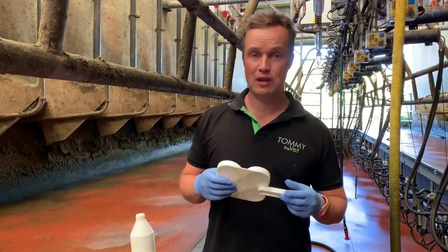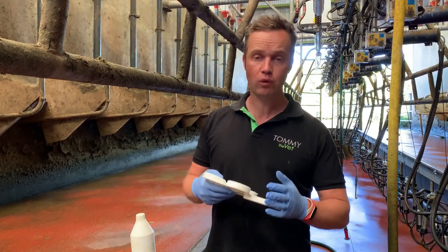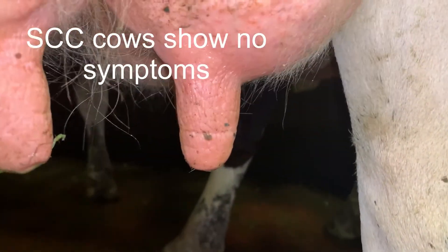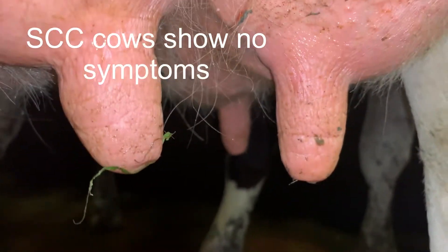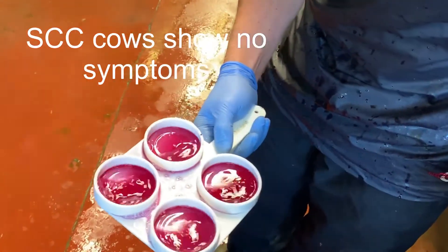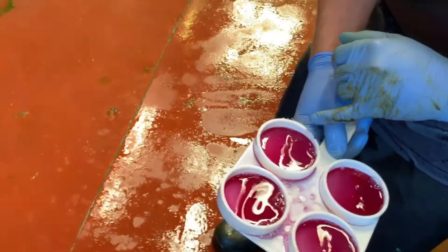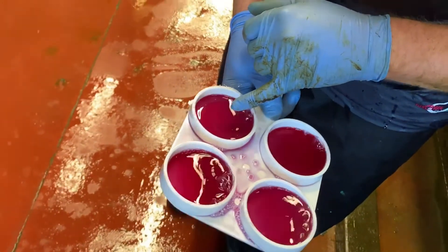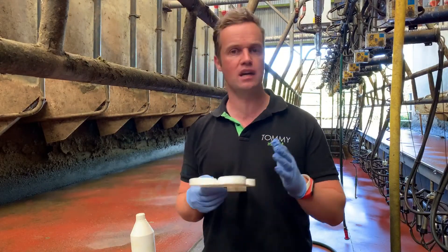I'm going to talk about the California Mastitis Test, a very simple cow-side tool that can be used to monitor infections. We're talking about subclinical mastitis and cell count issues — we often won't see changes in the quarter or the milk itself, so what we're trying to do is identify them. It's very useful when making decisions on farm, so it's a tool that farmers need to get comfortable using.